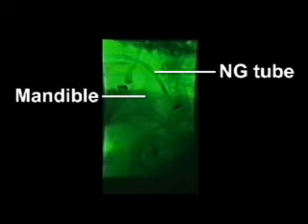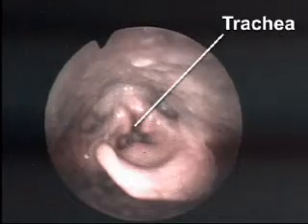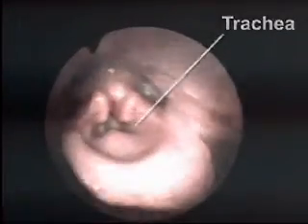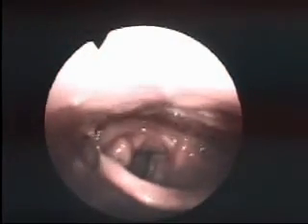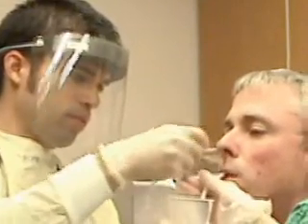This is a fluoroscopic view of a nasogastric tube being inserted. As the tube reaches the level of the larynx, advancement is temporarily halted. The tube is then inserted as the patient swallows and, once past the larynx, is rapidly advanced. Note that in this endoscopic view of the larynx, the trachea is frequently open and may be accidentally intubated with an NG tube. Note also that as the patient swallows, the laryngeal apparatus arises and the epiglottis covers the glottis, preventing tracheal entry. Once past the larynx, the tube may be inserted rapidly to the predetermined depth.